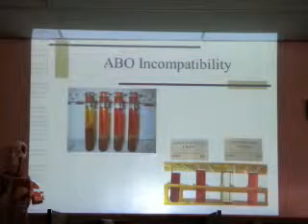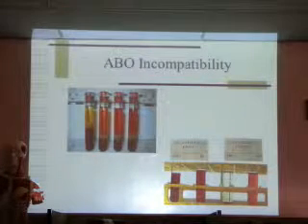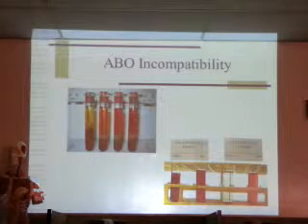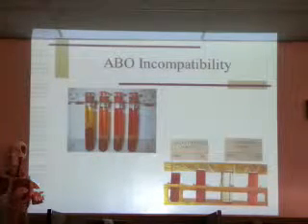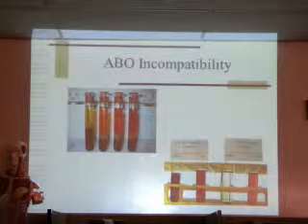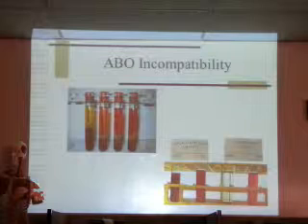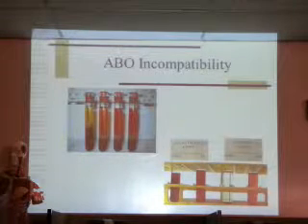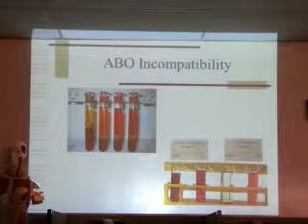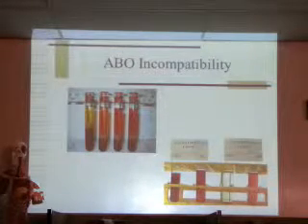Okay, so this indicates to me that there is a urinary bleed, and the supernate looks clear, so I'm not worried about a transfusion reaction. This, however, alarms me because it tells me there's hemolysis in the blood vessels, which is bad news for the patient. Okay?